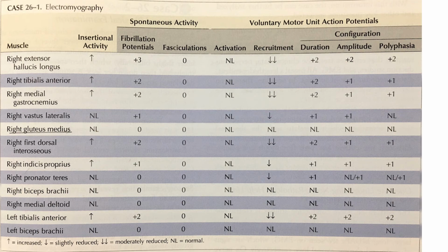Now let's talk about demyelinating neuropathy. So Dr. Rahul Khanna, can you similarly give us an example and talk about demyelinating neuropathies? How do they present and how can we identify them on the clinical EMG charts? Thank you, Dr. Singhal.